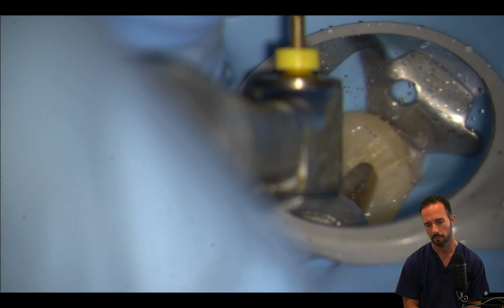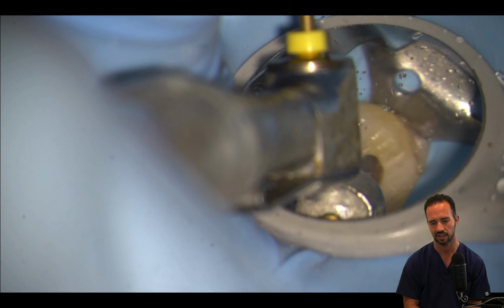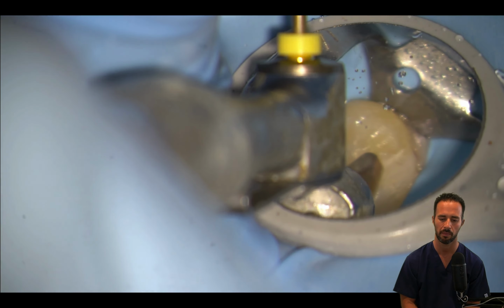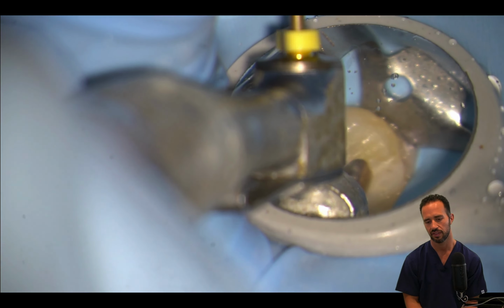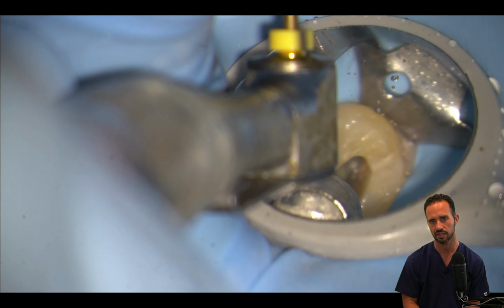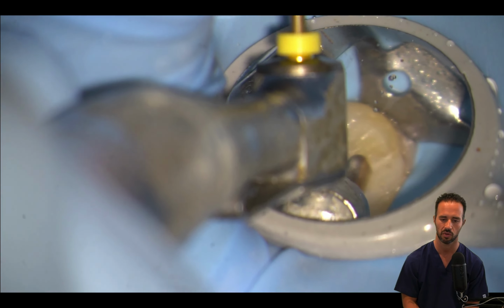So going back to my SX orifice opener and seeing if I can sneak it in, and we're not really getting anywhere. So we're starting to feel like there may not be an MB2 here. We're running into a solid stop. And this takes time. You really should be looking for at least 10 to 15 minutes before you throw your hands up and say that there's no MB2.